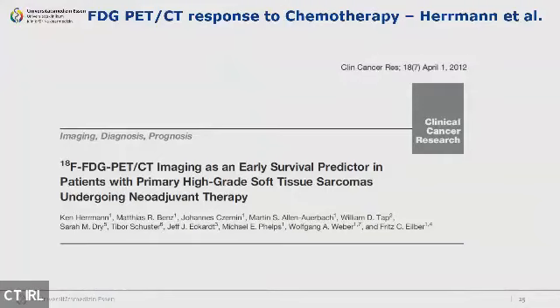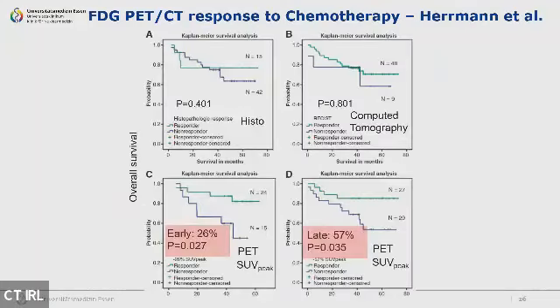So these patients underwent PET-CT imaging before treatment was started, and then after 1 or 2 cycles of treatment, PET-CT was repeated to understand if the change on our PET images really can predict the further outcome of the patient, can predict the survival of a patient and the time until tumor disease progresses and grows again. And this worked quite well.